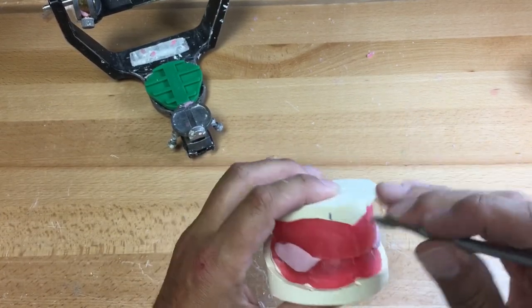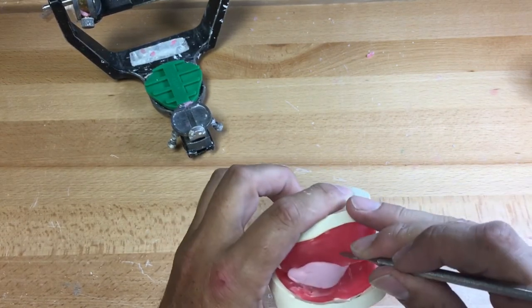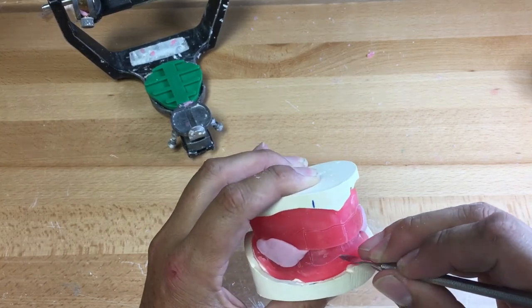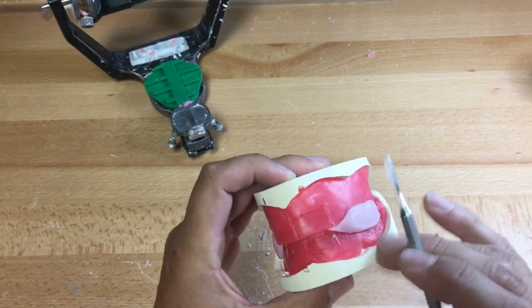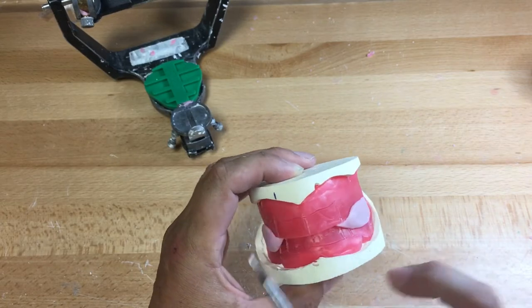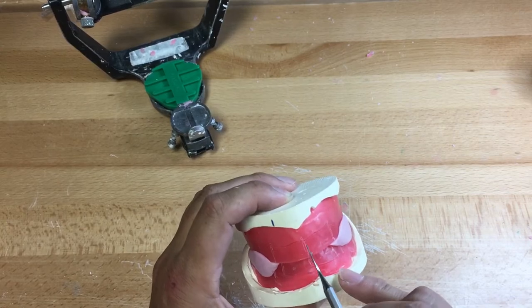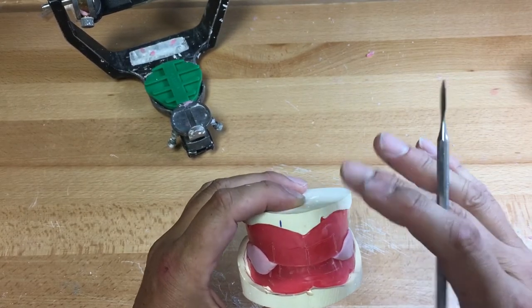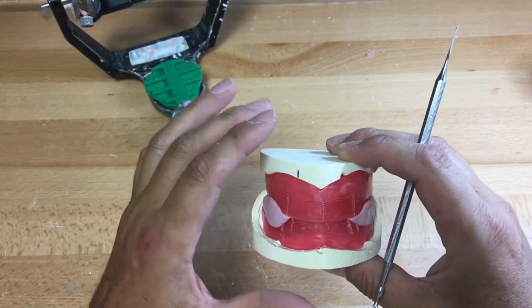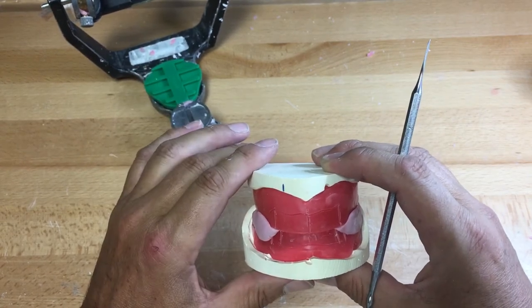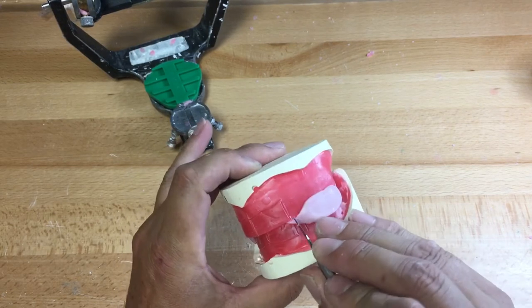So what we should have received back from the dentist is the midline, which you can see here is marked. The cuspid line, which is usually the alla of the nose brought down depending on the smile opening. And the midline is brought down onto the lower.